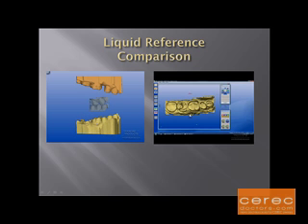The Liquid Reference increases the Z value on the buccal surface of the teeth, and I believe that's what helps with the stitching of the images. For individuals that have very deep bites, Liquid Reference is even more important. There are instances where you can put Liquid Reference on dried mucosa, and it will stay there during the imaging process and help one stitch those very difficult cases.